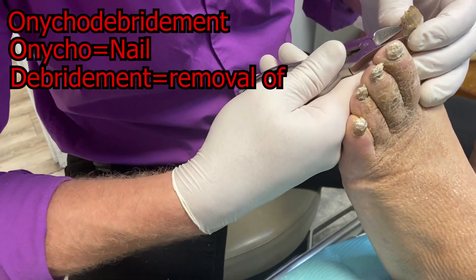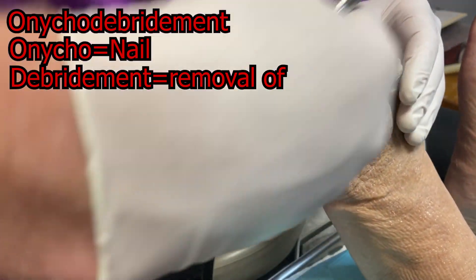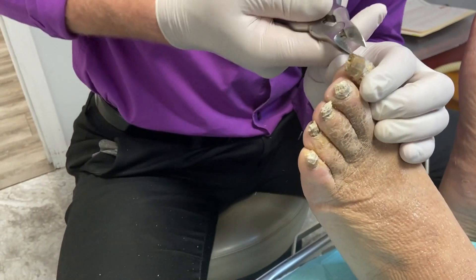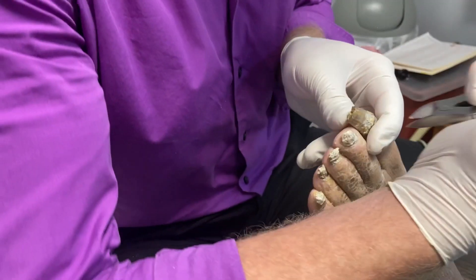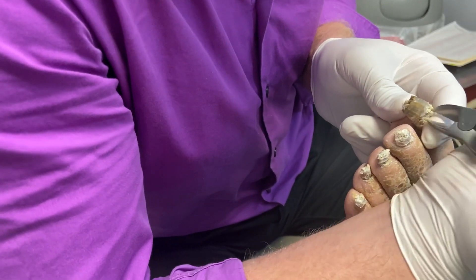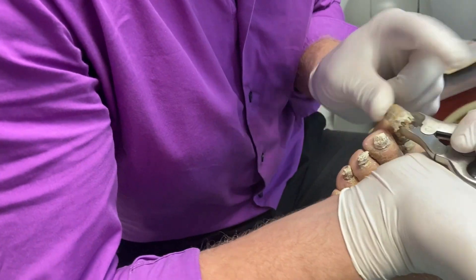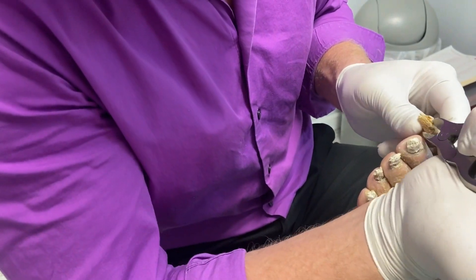Onychodebridement is the five-dollar word for removing toenails that are too long. Onychomycosis is typically caused by dermatophytic fungal infections — we'll be talking about this more in another video. Pretty much these fungi love to eat keratin in the skin and nails, and this guy's definitely got a party going on in there.